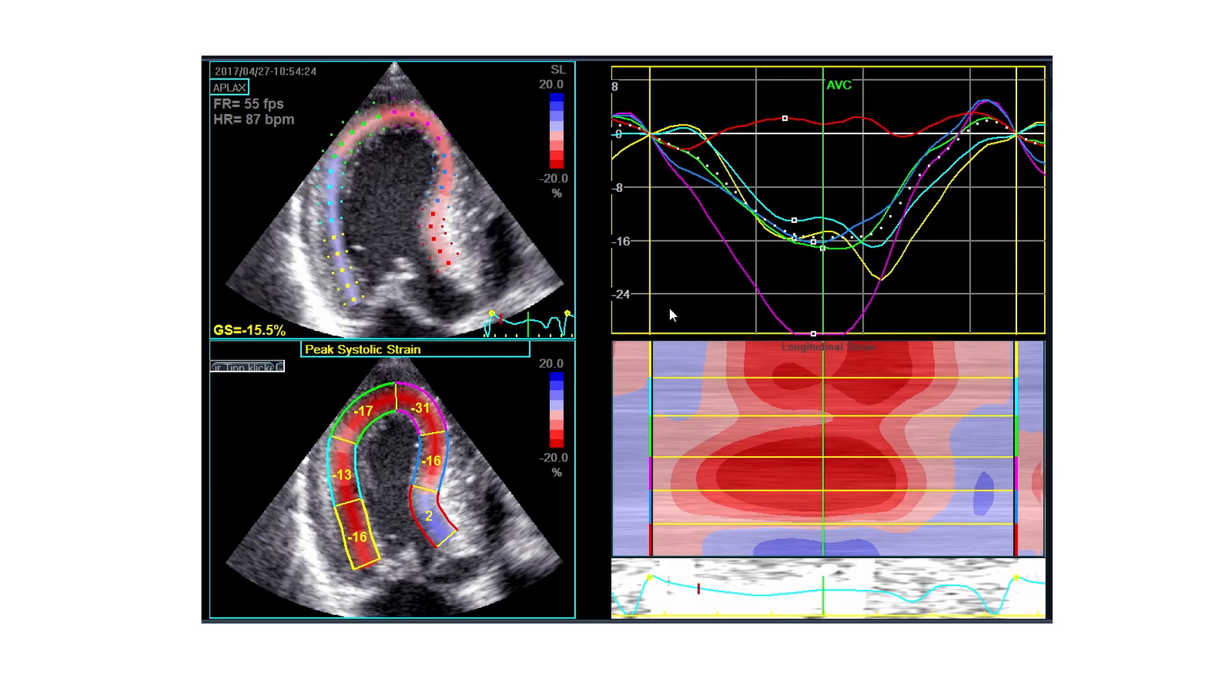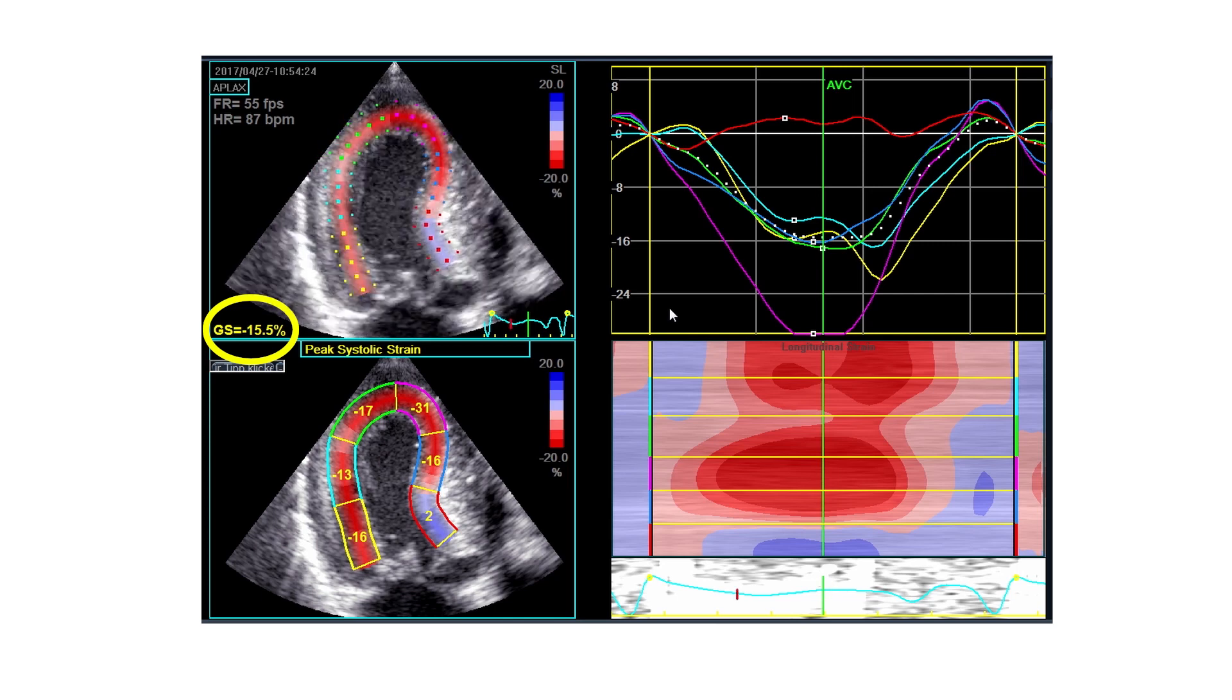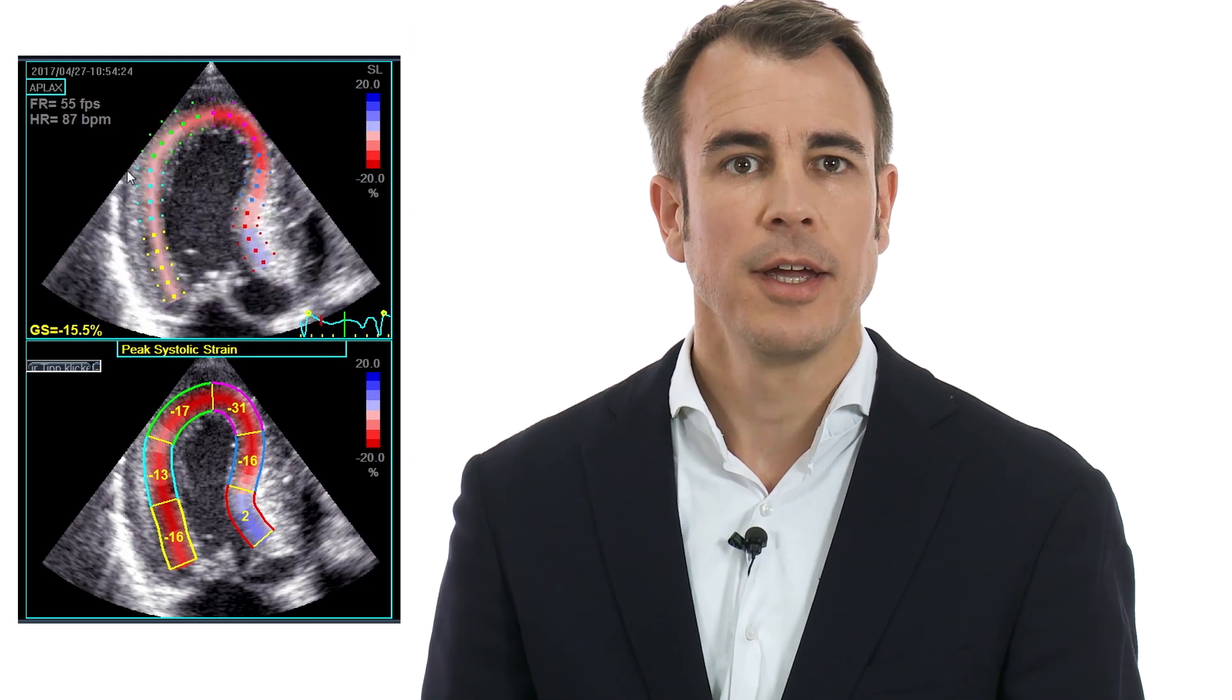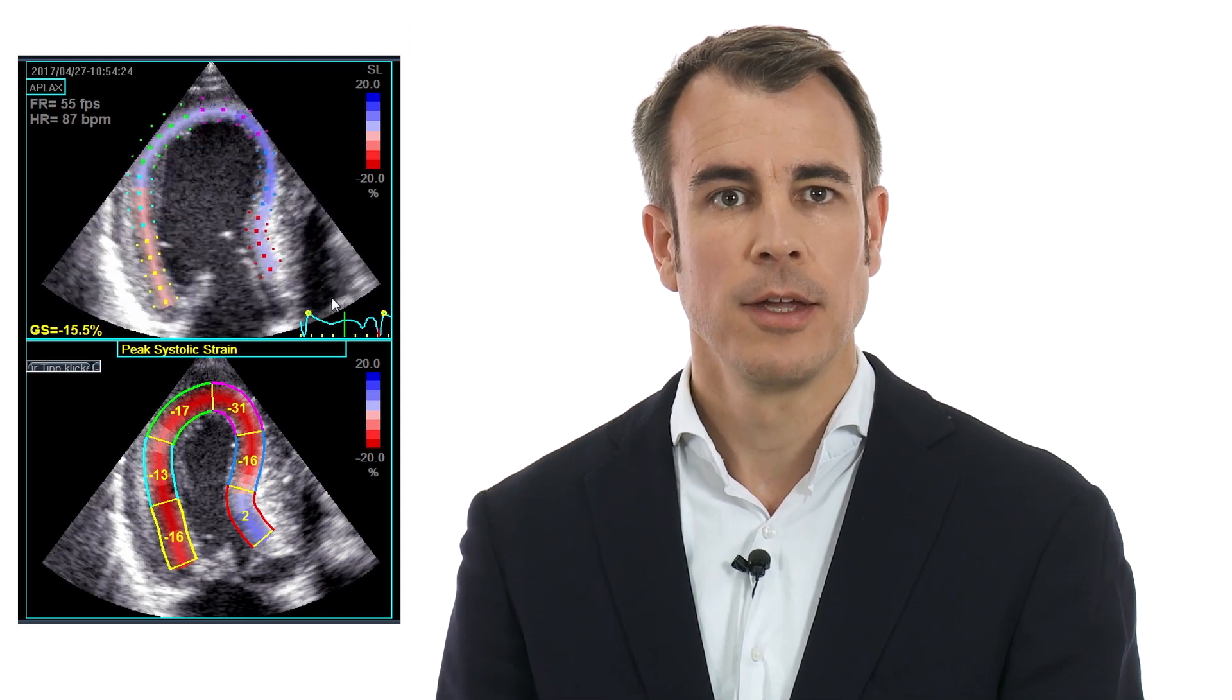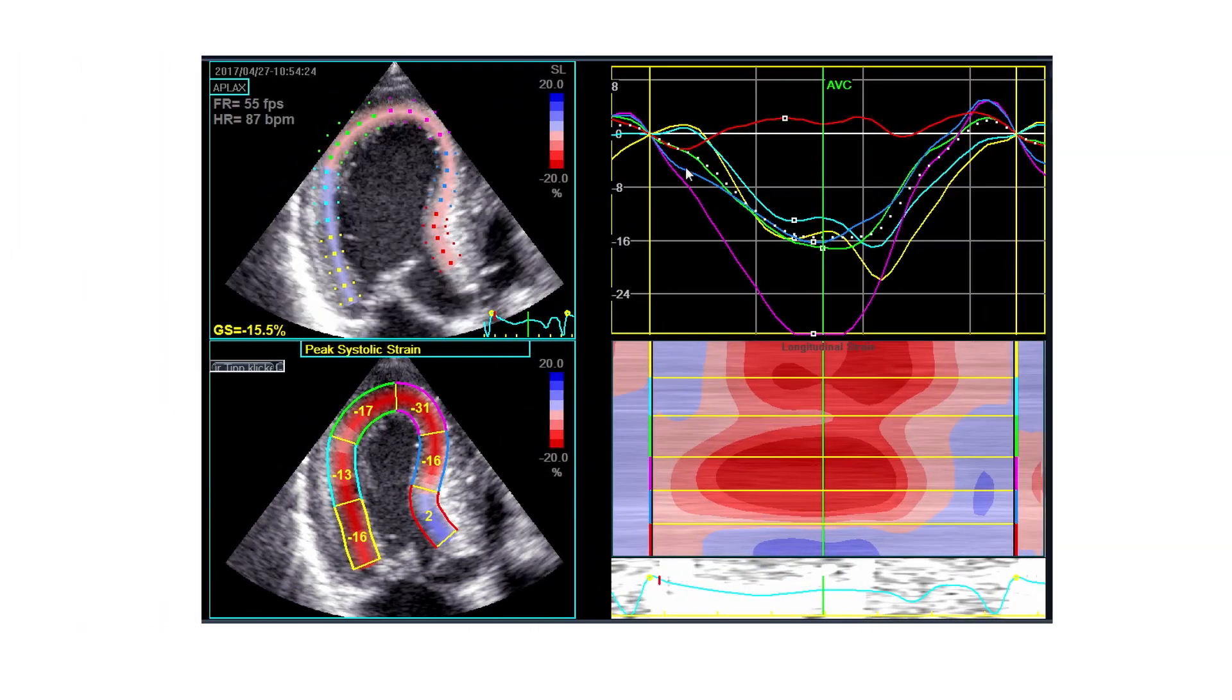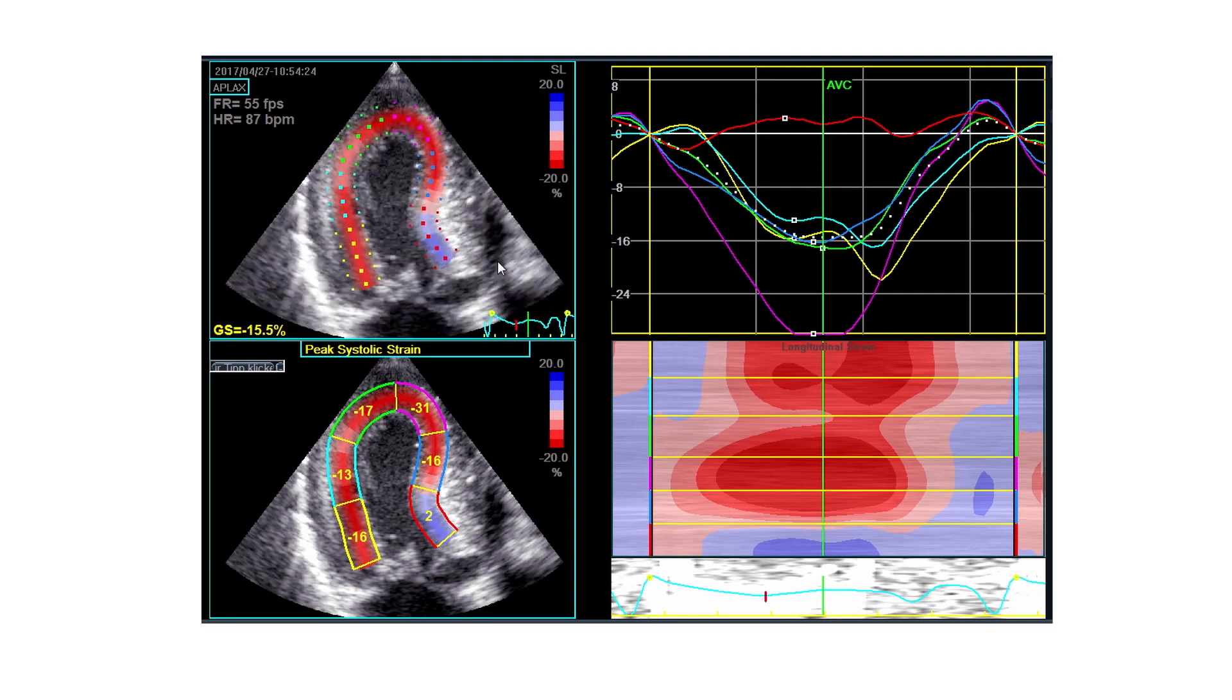Okay, so the strain we get in this specific case now would be in this view minus 15.5, which is definitely reduced. But what does the regional strain tell us? You can see on the left upper image that the basal anteroseptal segment is reduced—that the longitudinal function here is very bad. You can see no red color in this segment, and you can also see in the curves here that this segment has almost no longitudinal contraction.